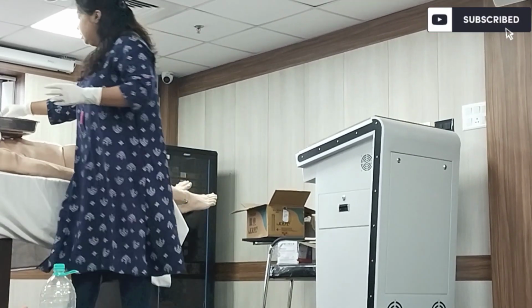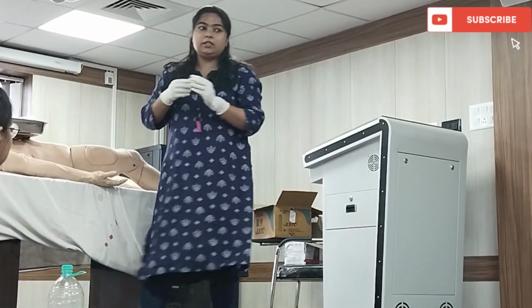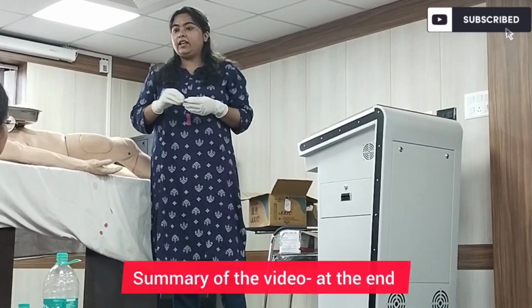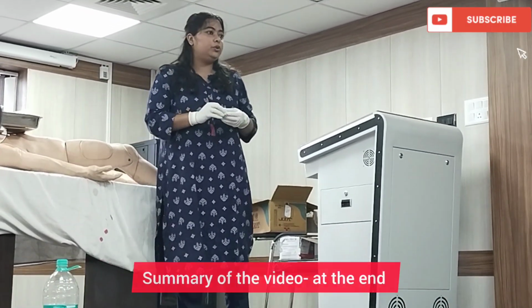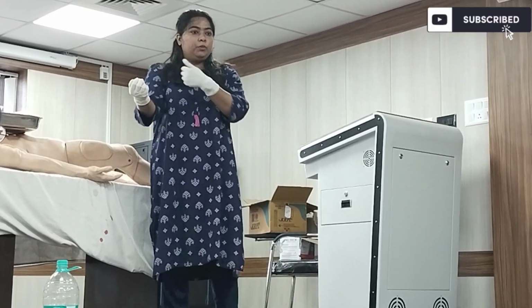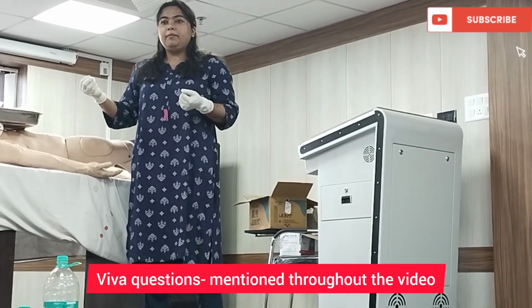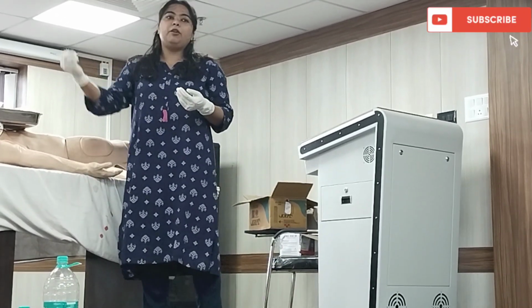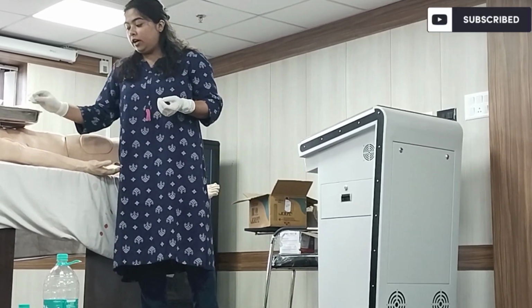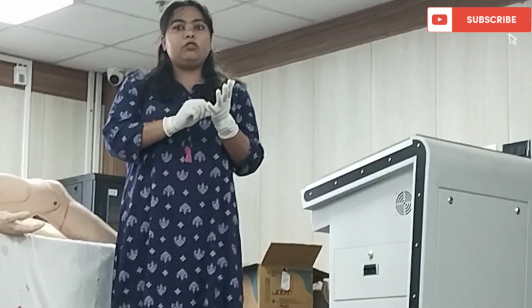We will have some sterile cotton over here. First of all, we have to clean the area from where you are going to draw the blood. Usually, we go for the antecubital fossa. Other than that, sometimes it is not recommended though. If you cannot draw blood from peripheral veins, then you go for the femoral. But for this purpose, we go for the antecubital fossa and draw blood from there.